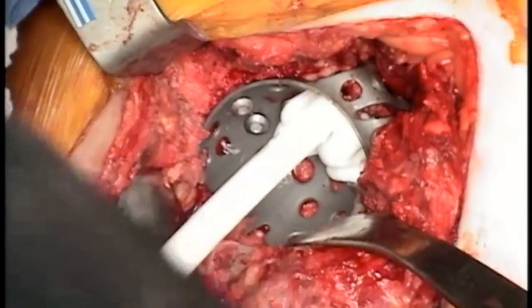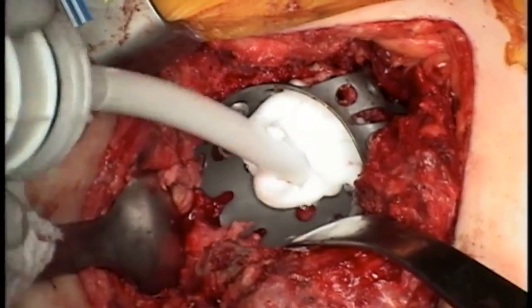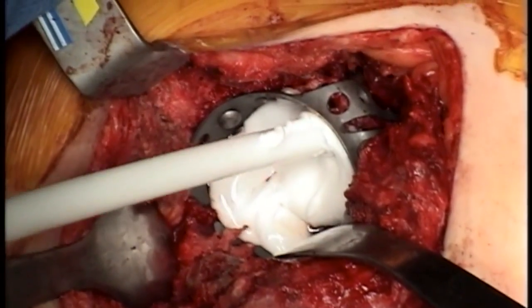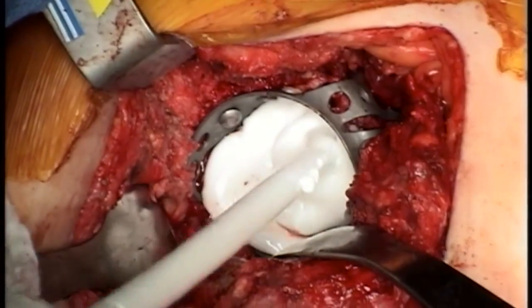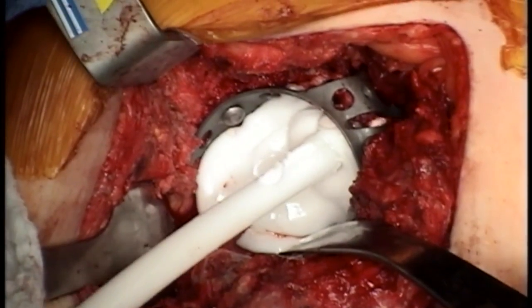We are now ready for cementation of the polyethylene. Be sure to make sure that the cement is fairly runny so that you have ample time to work with it. This also helps the cement get behind the holes of the cage to help provide further stability for the polyethylene cup when it's implanted.